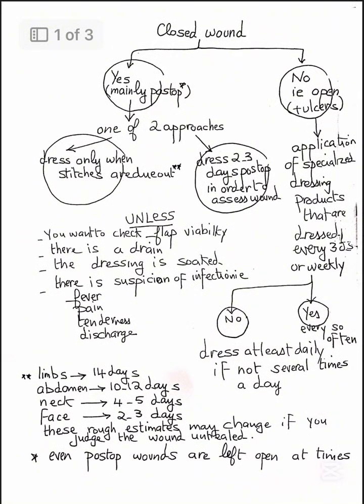Let's address the clinical reasoning behind drain usage. Why do we insert a drain? Drains are essential to remove accumulated fluid, such as blood or pus, as discussed earlier. How are drains fixed? They are often secured using sutures or adhesive devices to prevent displacement. We must also ask, which type of drain is appropriate? The choice depends on the surgical site and purpose, whether it's for passive drainage or active suction.